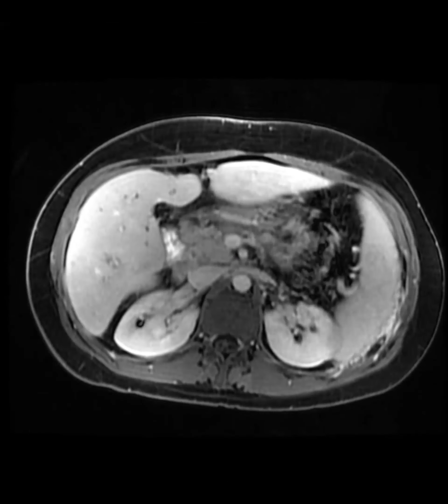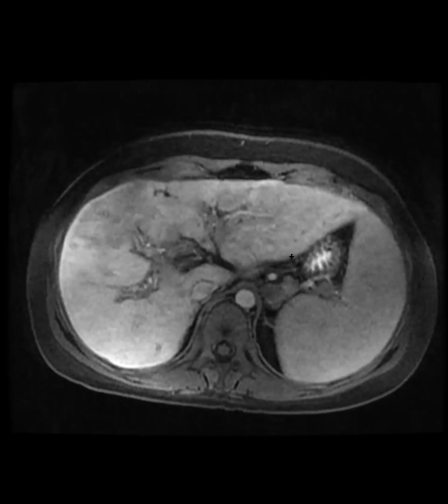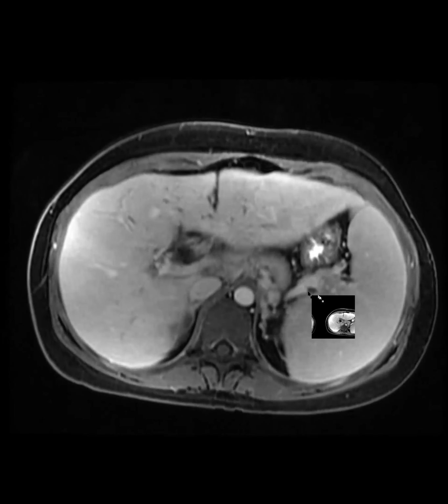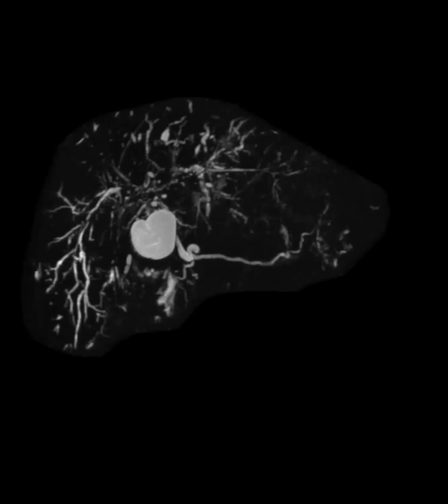This is a patient with PSC. Here, I'll give you the pre-transplant MR. This is your arterial, and venous. MRCP for fun. That's a really nice MRCP for PSC. It's beautiful, isn't it? Here, let me give you the MIPs. You can see the beading nicely. Yeah, it's a really nice example.